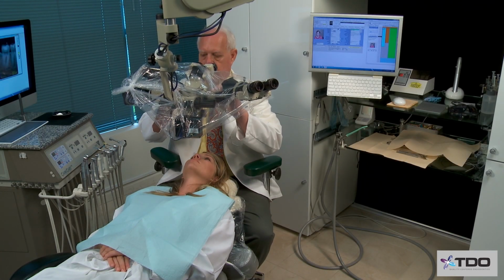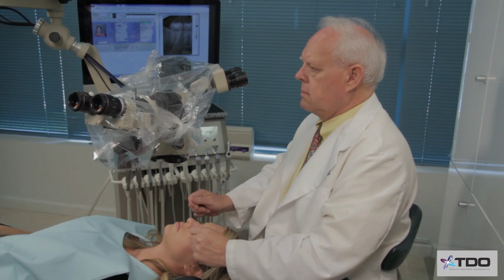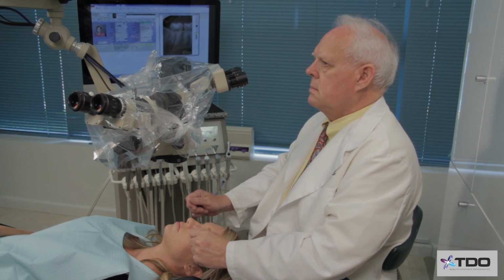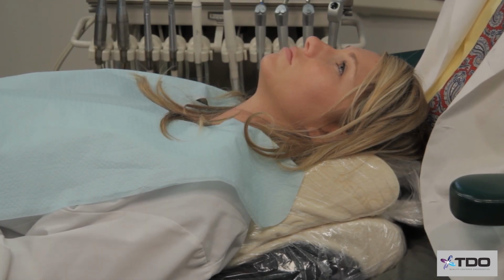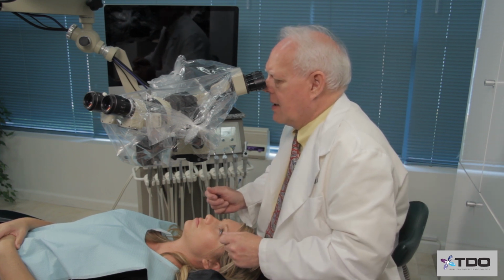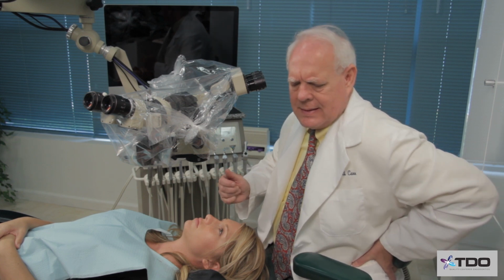In positioning yourself at the chair, take particular care to make sure you are not bent forward either at the neck or the back. To accomplish this, you will need to have the patient's head essentially in your lap, as seen here. If you have to bend forward, as seen here, you will develop lower back pain syndrome for certain.